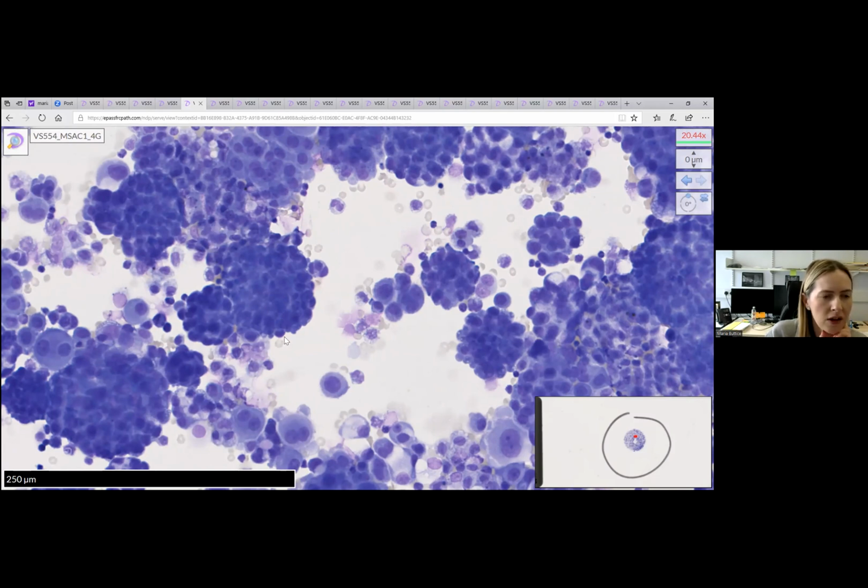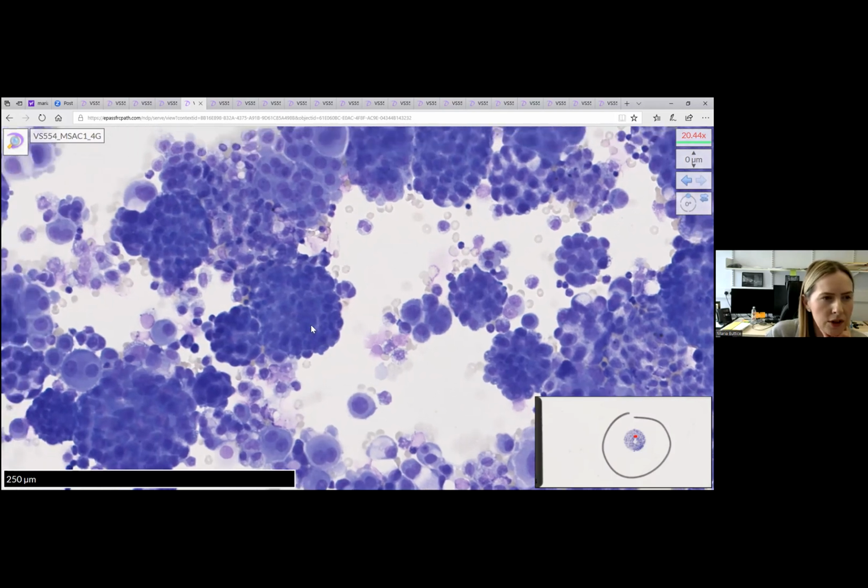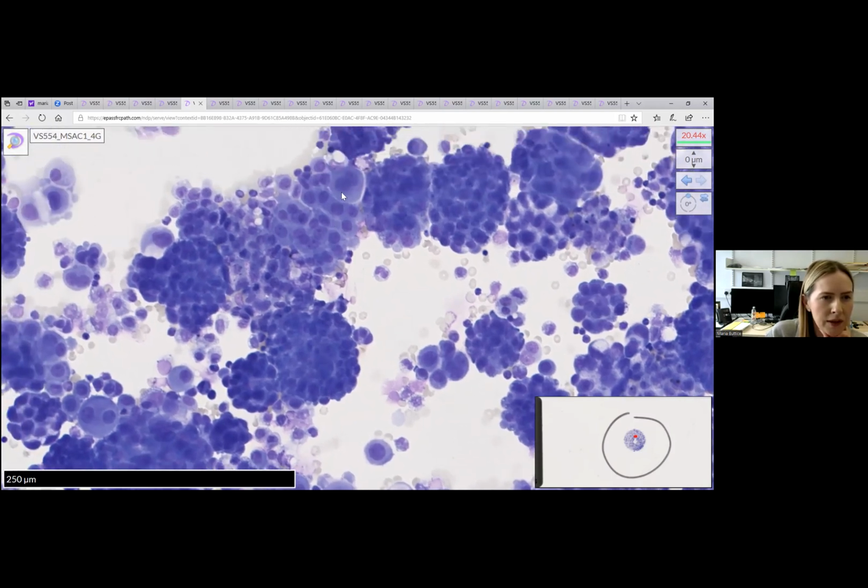The other sign is to look out for cytoplasmic vacuolations, which are often characteristic of adenocarcinoma. And I don't see those in these cells here. Also, the degree of pleomorphism. So these are variable, but they look like they're arising from the same population, so mesothelial cells. And again, the cytoplasm quality is the same as is the nucleus. So I would identify these as mesothelial cells.